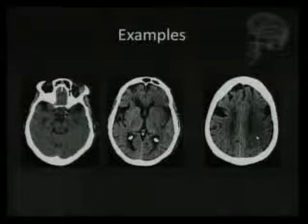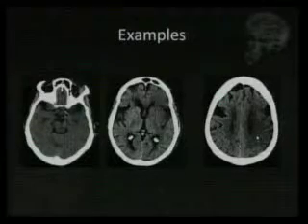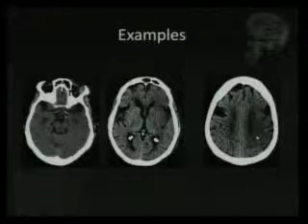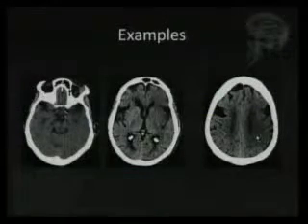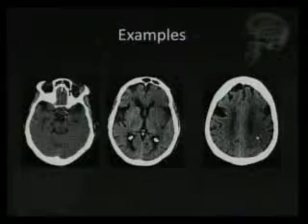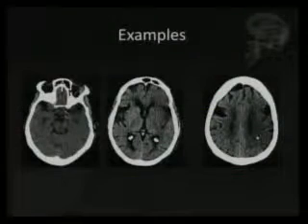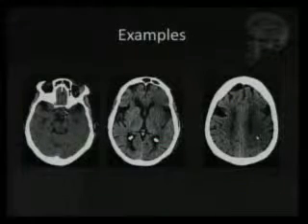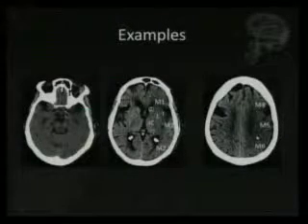So we have this other one, hyperdense MCA sign. And then we see the scan, basal ganglia, M1, well, that's a little hypodense compared with this. There's loss of gray-white matter differentiation. Sulcal effacement, we can see the insular ribbon is hypodense here. Posterior lentiform, maybe more hypodense here than the contralateral side. M3, M2, maybe they're okay, maybe there's still some gray-white matter differentiation. At the centrum semiovale, definitely hypodense here posteriorly, M6, M5, middle. Anteriorly, you may want to call it, maybe not. So we have M1, insula, lentiform, M5, M6.